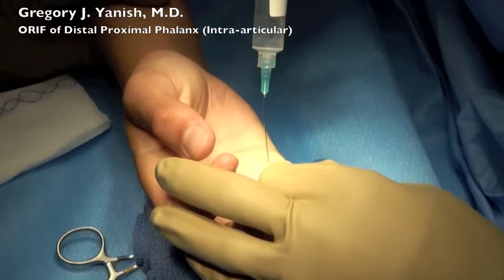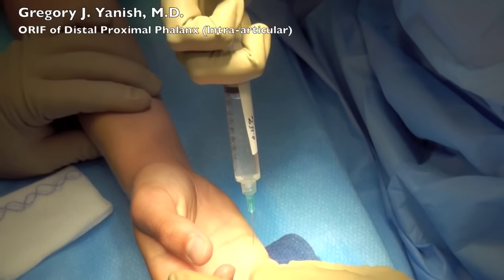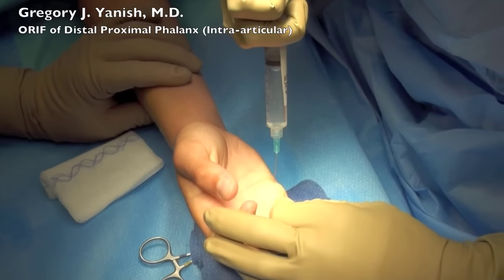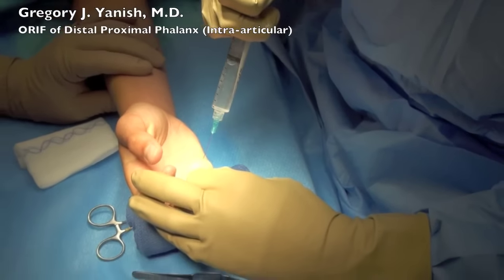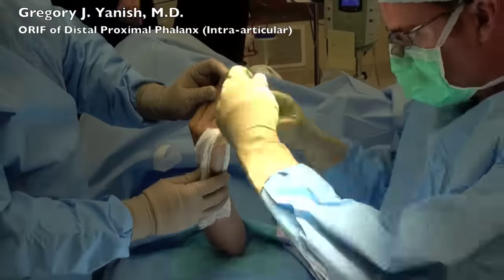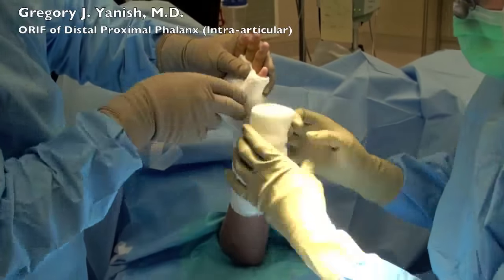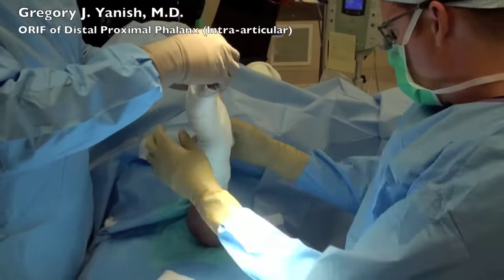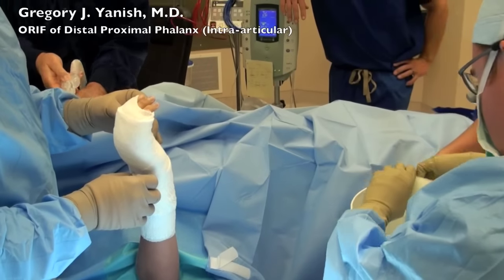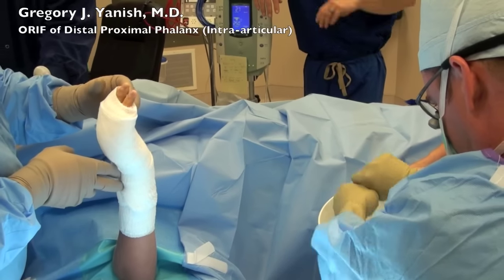The sutures are in, and then we'll place some local anesthetic so that when the patient's arm wakes up, the finger is numb and pain-free. Then the sterile dressing and splint is placed over this hand, using bulky super fluff sponges and curlex, followed by a custom splint which has been dipped in water and is a fiberglass wrapped in soft cotton padding.